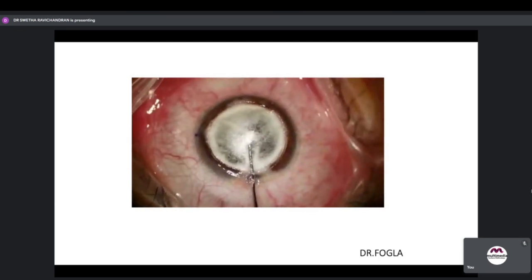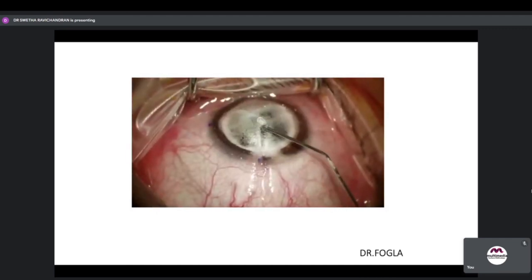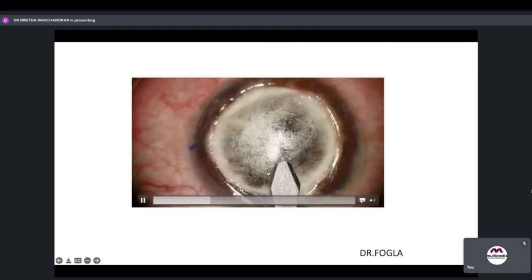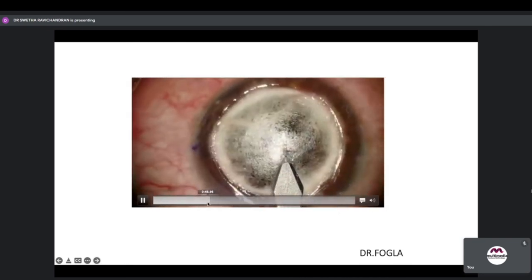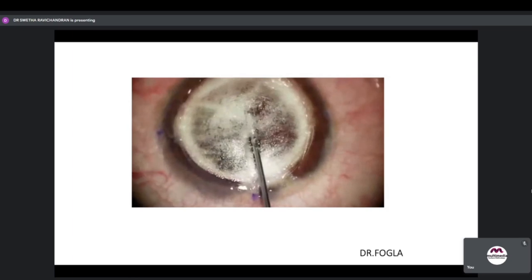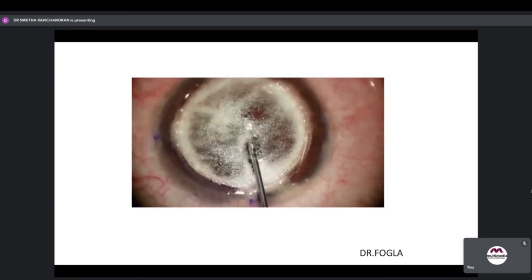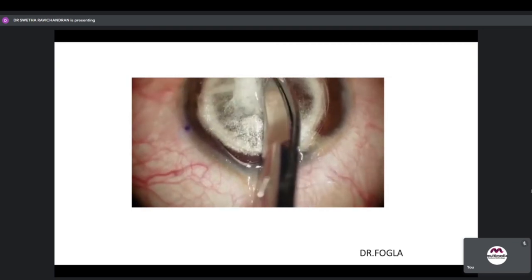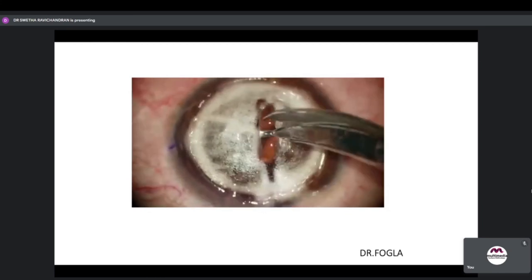Once the spatula is in with a fairly good big bubble achieved, decompress the chamber to allow the bubble to reach the periphery. Apply Helon on the surface, then use a keratome to make an entry parallel to the DM — this reduces the risk of hitting the DM. Once the plane is created, inject Helon to push the DM back, then use Vannas scissors to cut the tissue into four quadrants. Throughout this phase, keep decompressing the anterior chamber to maintain very low IOP.